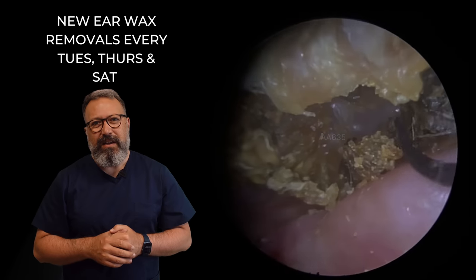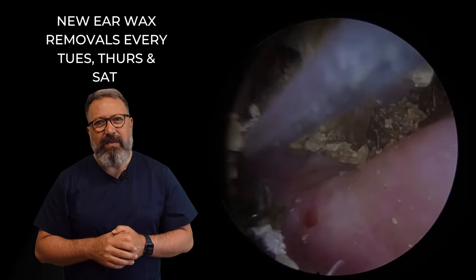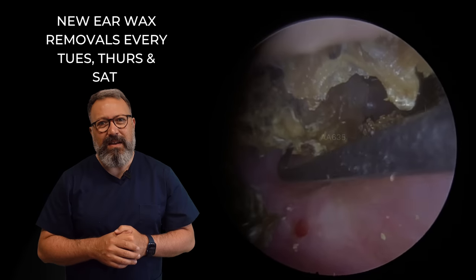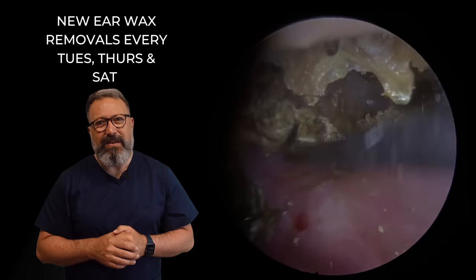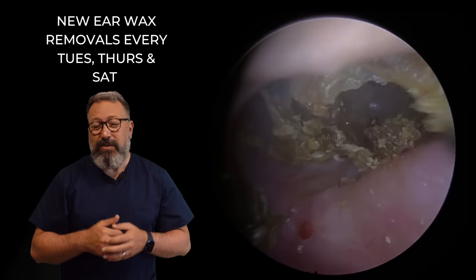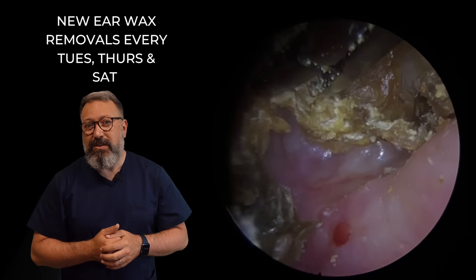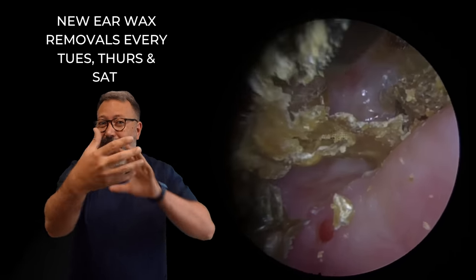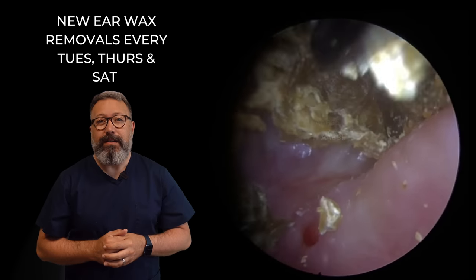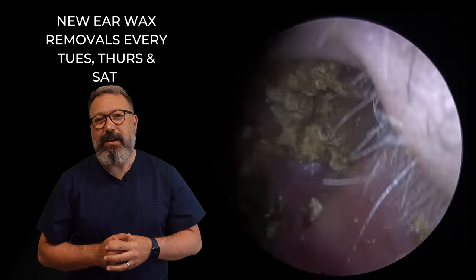Let's have a little look. This is going to be quite a delicate place. Let's get this piece from the top here — it's just in the way a little bit. Let's lift — nearly. You can see I'm just probing along the bottom of it, just to see if we can get this to loosen. Did you see that start to pull away there? Now we've lifted that off — can we get the forceps on this, or is it going to be too wide? Look at that — that whole section just twisted around there. Just looking for anywhere we can get some purchase on this. This is tough, tough stuff.